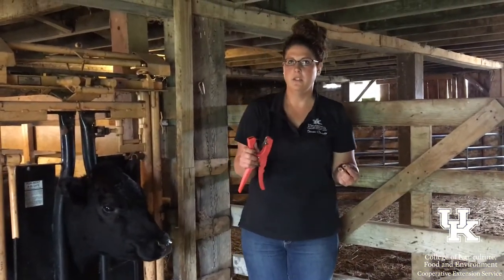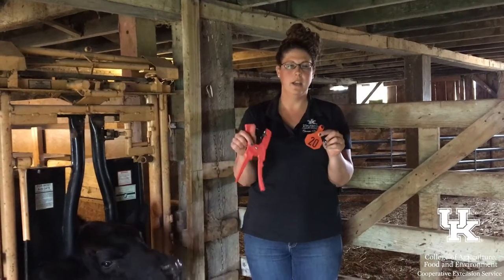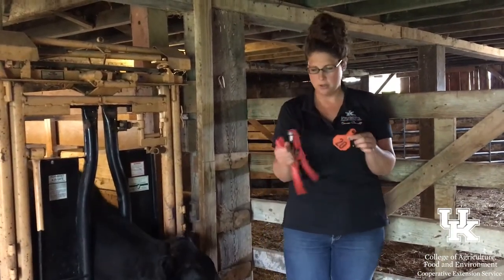When you're putting an ear tag into a cow, it's really important to use the same brands on your ear tag and your ear tagger. Sometimes they don't work the same way if you've got a different brand.